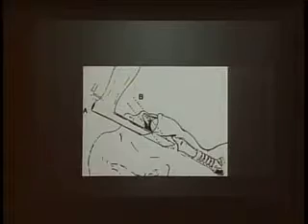Just does. I can use a 1 Phillips blade in a 9, 10 and 11-year-old. Okay, I would never pass you if I said what size blade and you pick that for a routine laryngoscopy because it's too short. Okay, but I can use this blade. So what I'm doing is I'm cheating. I'm going on the right-hand side. Everybody will say, well, can we do it?